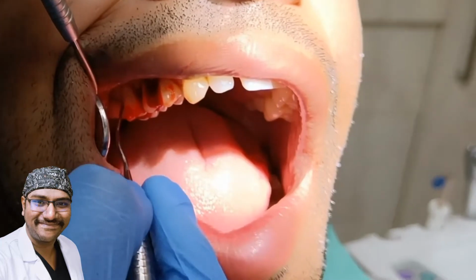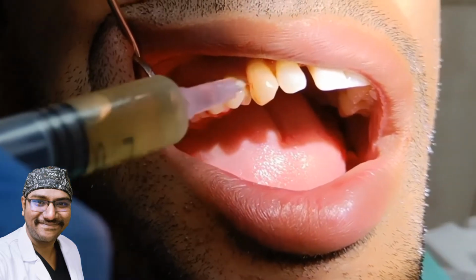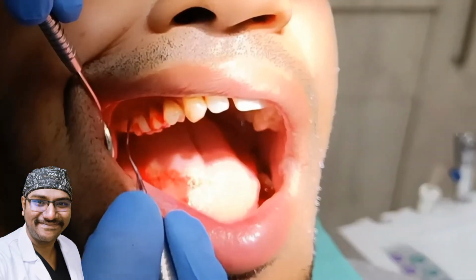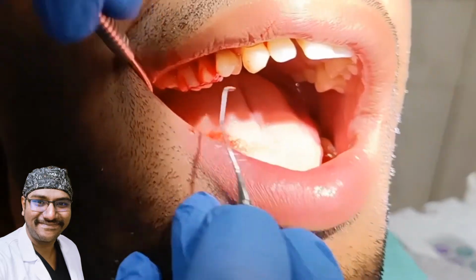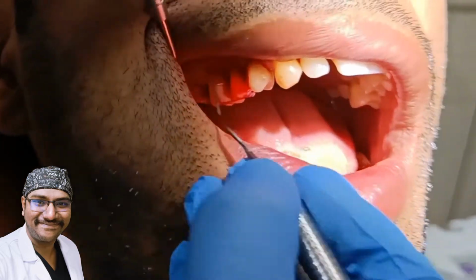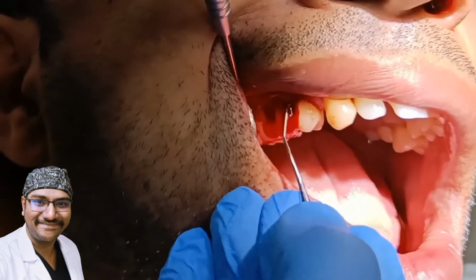So the more bleeding that is there, that means there is more infection, and as you can see, we are doing the betadine irrigation in the place, and that helps in debridement of the area before we go for the surgery. Viewer discretion is advised when it comes to the bleeding of the pockets. The deeper the pockets, the more likelihood of infection being more severe, and the likelihood of the edema and all the inflammation present in the gums, which is not visible to the naked eye just clinically, is basically seen and appreciated while we are doing the root planing and curettage procedure.